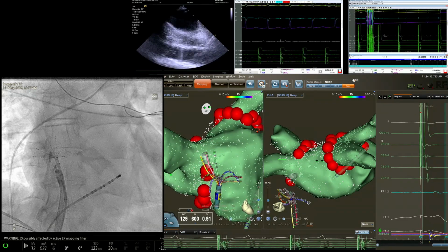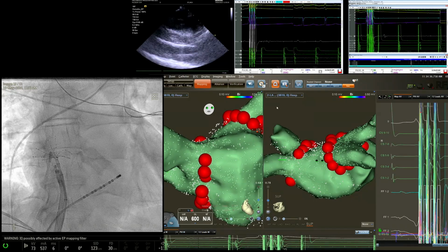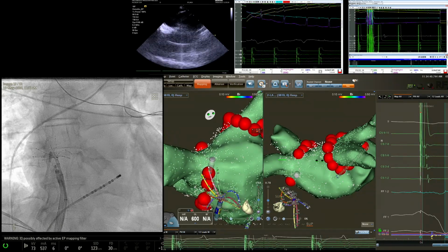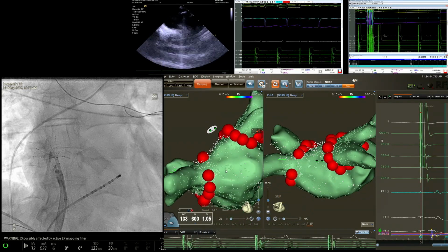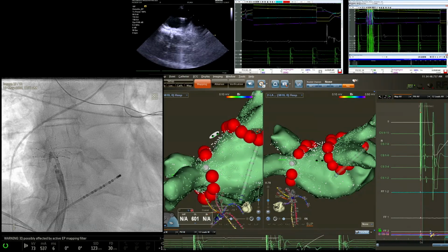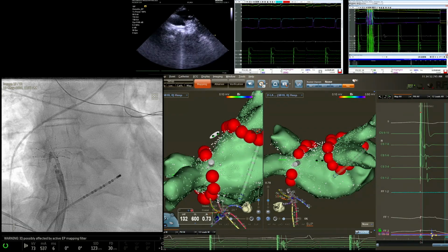Contact point. Yeah, unlike radio frequency ablation, I think what we care about is tissue contact. Frankly, what I really care about is tissue proximity. Point, hide, ablation. So as long as I'm touching tissue, I don't really care much beyond that. So it's a yes or no proximity indicator. Yeah, exactly. That's good. Point, hide, ablation.